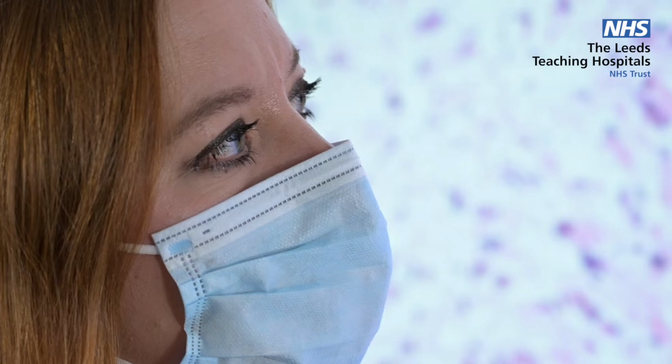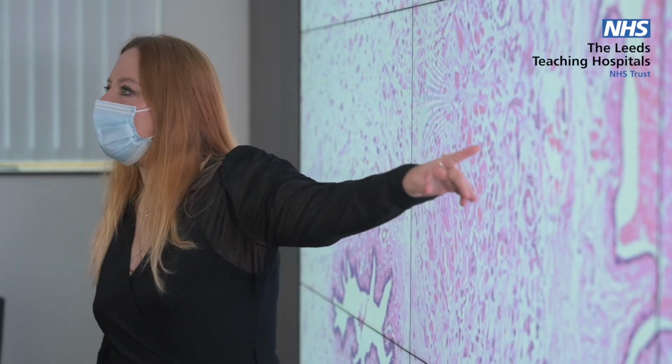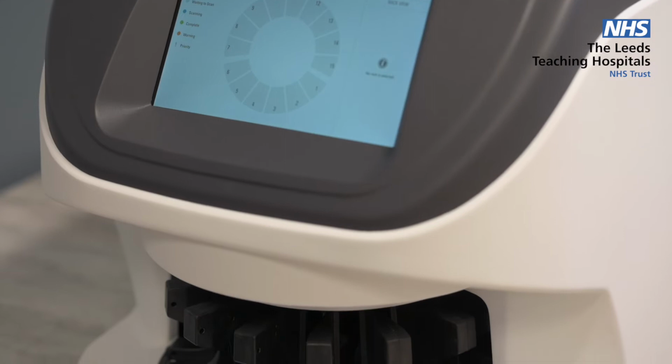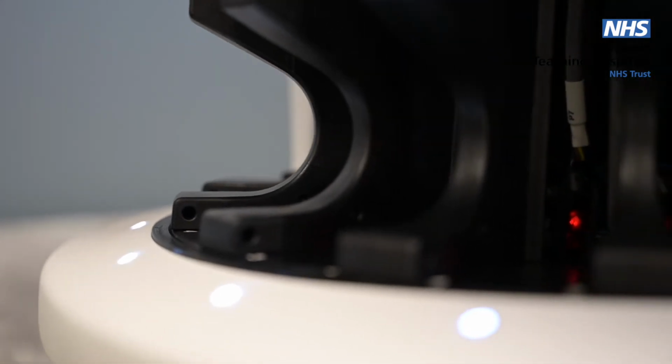The current biggest challenge in my job and nationally in pathology is an increasing workload, and this is due to there being more specimens coming in from patients, but also we need to do more and more tests on the specimens we receive. Digital pathology is in essence turning a glass slide with a piece of tissue on it into a digital image.